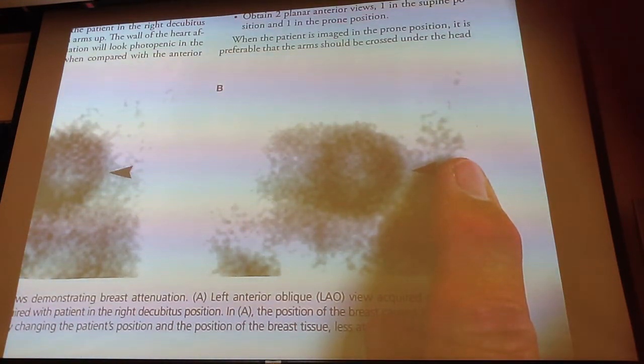The patient comes back 4 hours later, and you actually have a lot more perfusion than you had in the initial part of the study. Even one of the quality control tests that you're supposed to do for sestamibi: you're supposed to have 10 millicuries for the first phase and then 30 millicuries if you did the same day protocol.